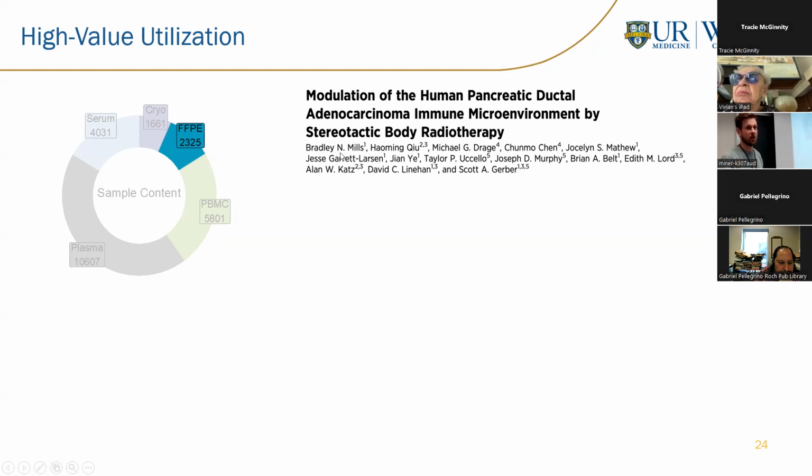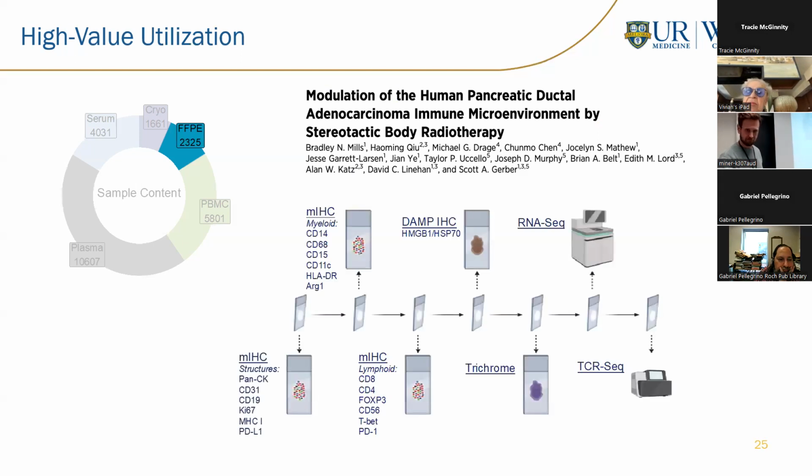And even though radiotherapy doesn't cause a robust response and increase survival in patients, we thought it did have an effect on the tumor and could really promote an immune response against that tumor. And that's what we wanted to show. We wanted to highlight that, hey, something's happening in these tumors. We just need to build upon that, possibly with a secondary treatment. I don't want to get too wrapped up in our findings. I'm more so using this example to show some of these analytical approaches and thinking about spatial omics and how to build a story just by looking at that in situ tumor, right?